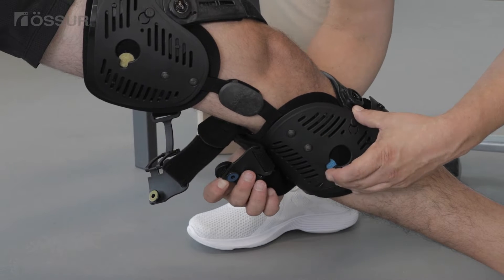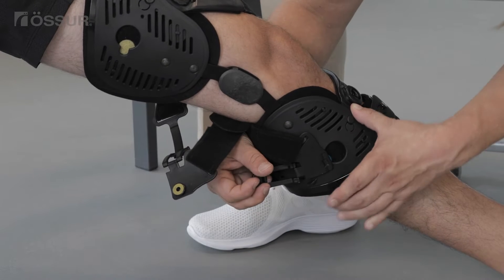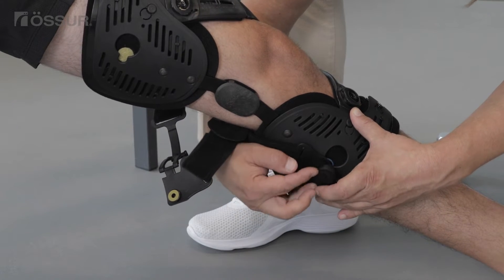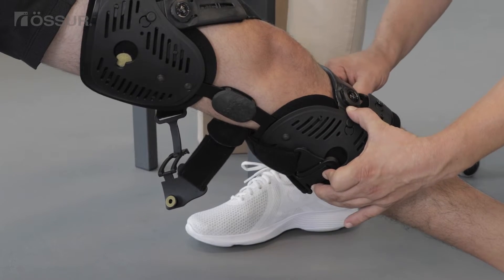Place the button of the blue quick fit buckle into the blue keyhole above the buckle stability shelf and close. Use the alligator clip to get an appropriate snug fit of the calf strap.